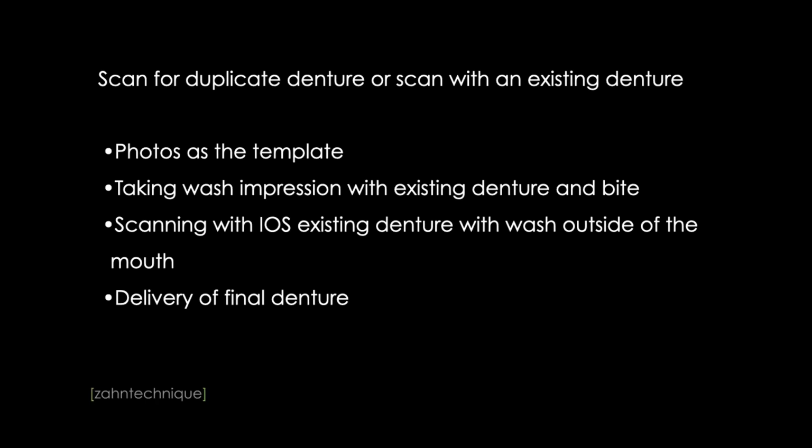We're taking a wash impression with the existing denture and the bite. And then we're scanning the denture with the wash outside of the mouth with the intraoral scanner. Yeah, you don't scan it inside of the mouth. You maybe capture the bite inside of the mouth, but you take the denture out with the wash and you scan with the protocol outside of the mouth. And actually, then that is already the delivery of the final denture. So theoretically, you can have a duplicate denture in 2 appointments, right? Taking the records, delivering the final, which is really amazing.